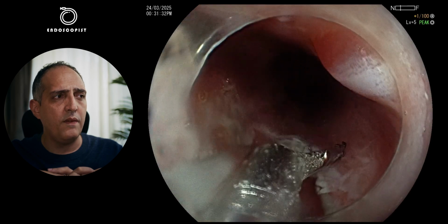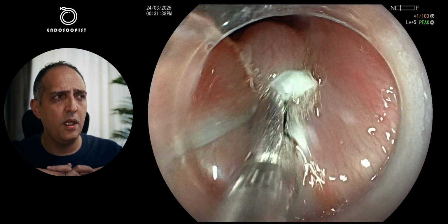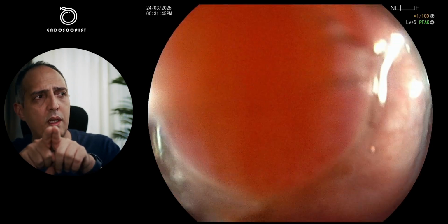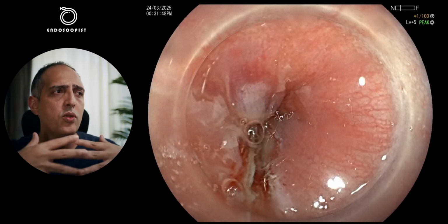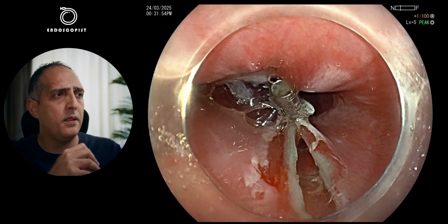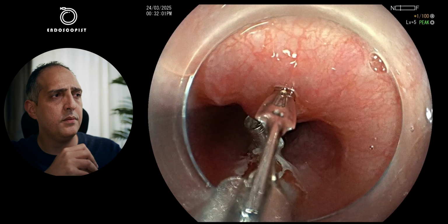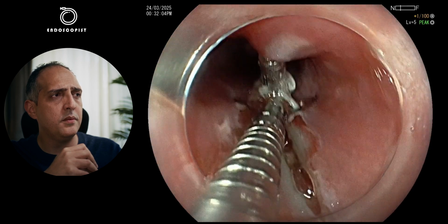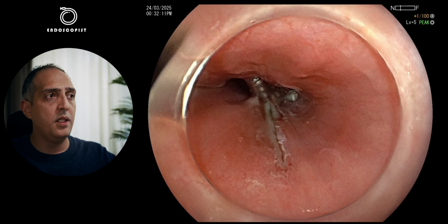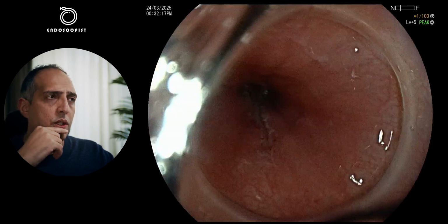Usually I will put the first clip just below my mucosal opening. I use very small clips, 11 millimeter. When I put the first clip, it will make a fold, so it will fold the opening, approximating the two edges together, which will help me to do a very tight closure after that. Here's the second clip. And I pull, or I push downwards, then I close the clip, and it will grasp the two edges. I keep a small distance between the clips to achieve a very tight closure every time.